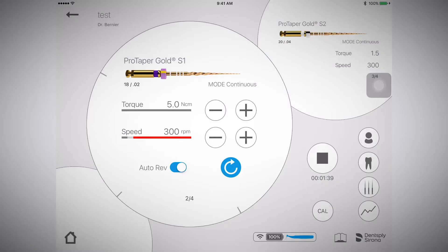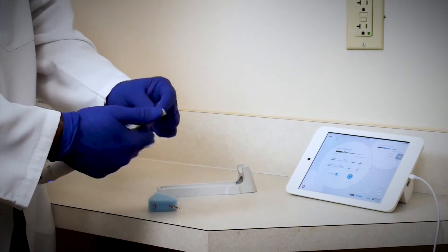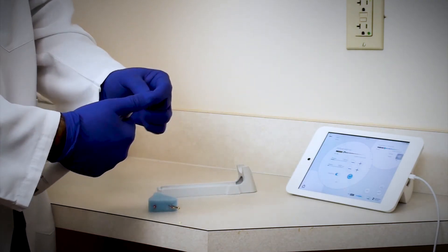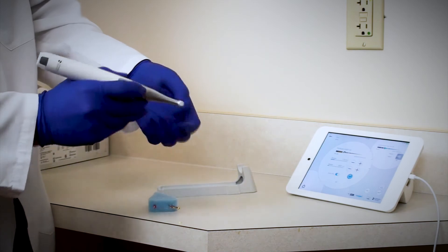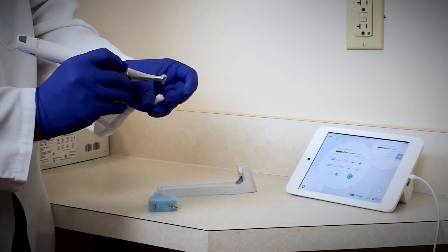Once you have moved to the next file within the app, you will want to switch out the file within the motor handpiece.